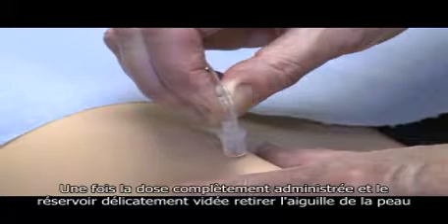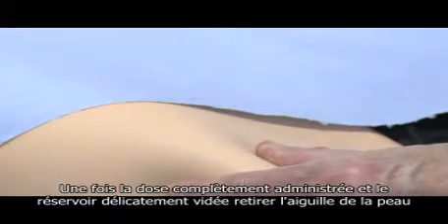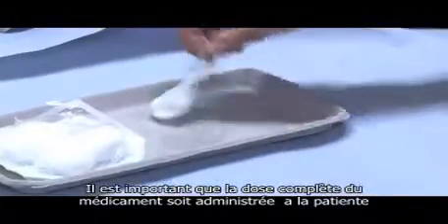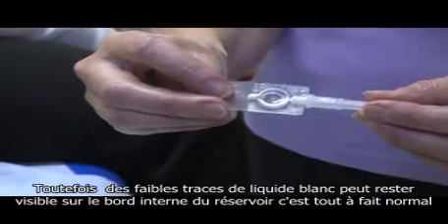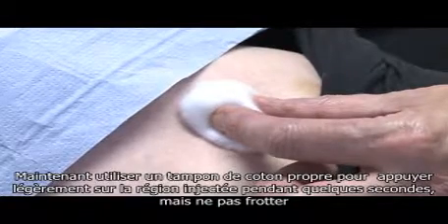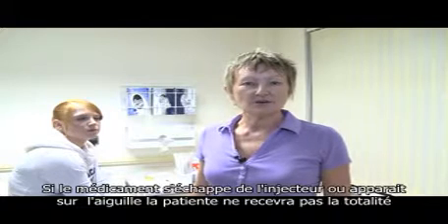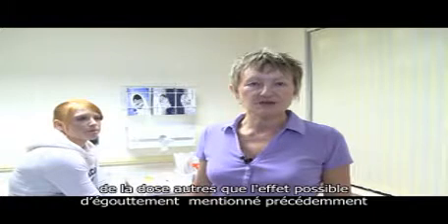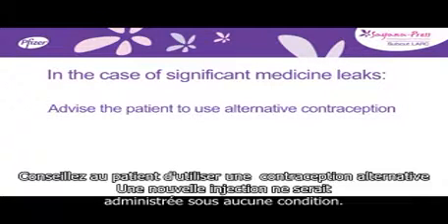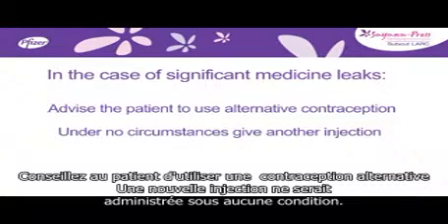After the dose has been completely injected and the reservoir has collapsed, gently pull the needle out of the skin. It's important that the full dose of medicine is given to the patient. However, small traces of the white liquid may remain visible inside the edge of the reservoir — this is quite normal. Now use a clean cotton pad to press lightly on the injection area for a few seconds, but do not rub. In the unlikely event that any of the medicine leaks out of the injector or appears around the needle, then the patient will not have received the full dose other than the possible drip effect mentioned earlier. In this case of significant medicine leaks — that is more than one to two drops — it is important that you advise the patient to use alternative contraception. Under no circumstances should you attempt to give another injection until the next scheduled injection.